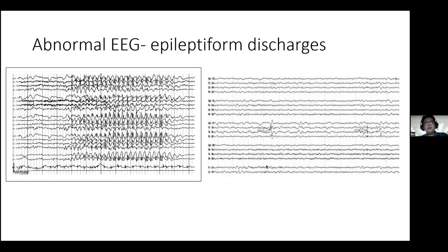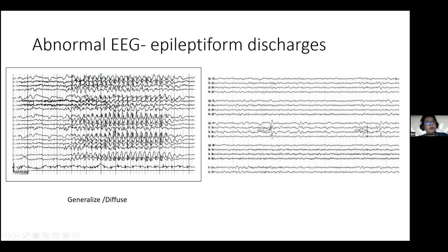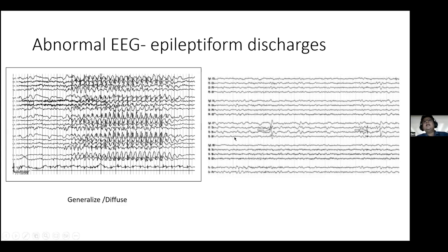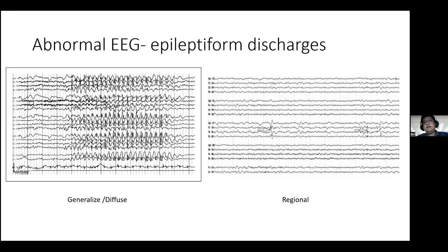Regarding epileptiform discharges, they can be generalized or focal. A classical example of generalized epileptiform activity is the 3 Hz spike-and-wave pattern seen in certain genetic epilepsies. On the right is an example of regional temporal epileptiform discharges.